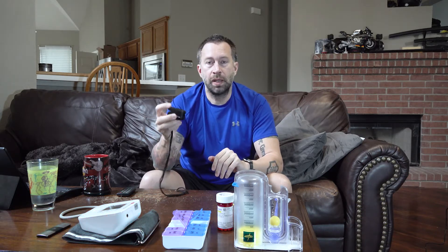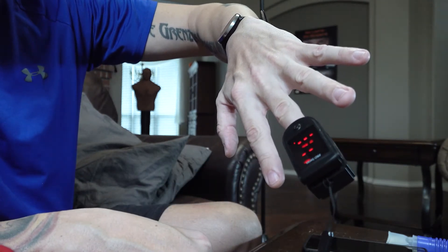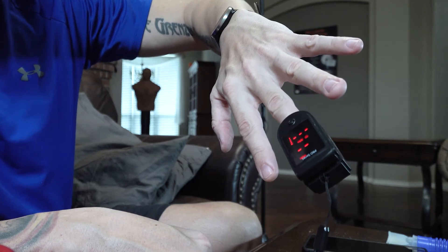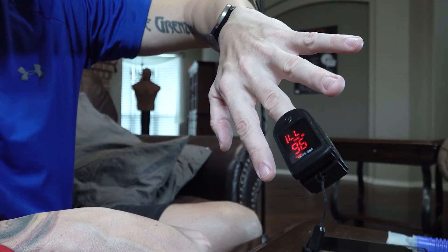The first tool I'm going to talk about is one of the most basic: a pulsometer, oxygen sensor, or whatever you want to call it. In the hospital they've been replaced by a tape-on device that connects to a monitor, but you can buy these for about 20 bucks. It's very simple to use — turn the power on, squeeze it, put it over your index or middle finger, and it will tell you your oxygen levels and your heart rate.